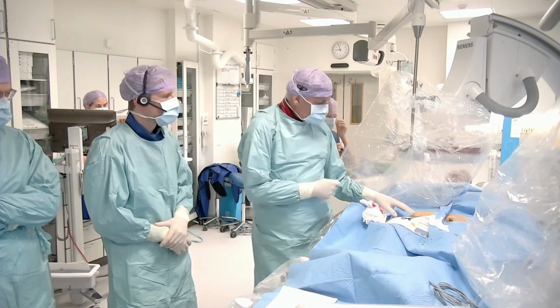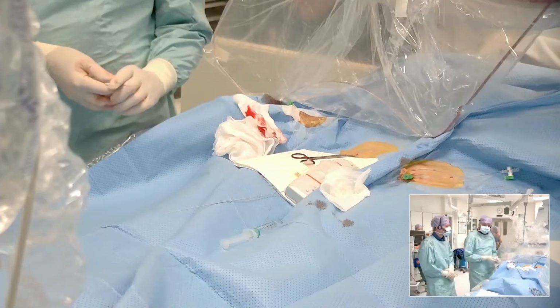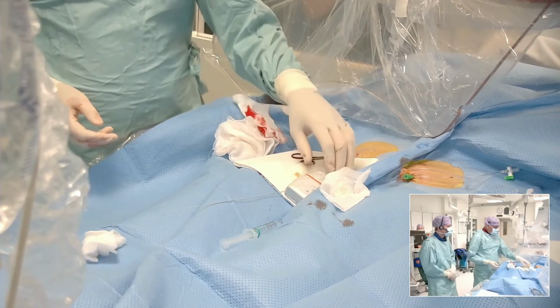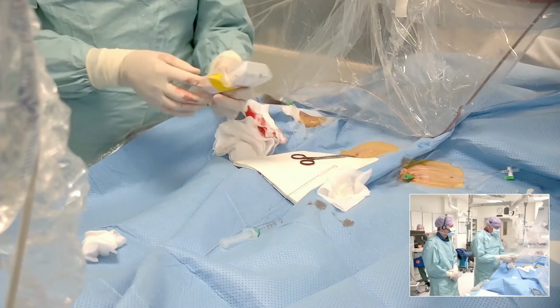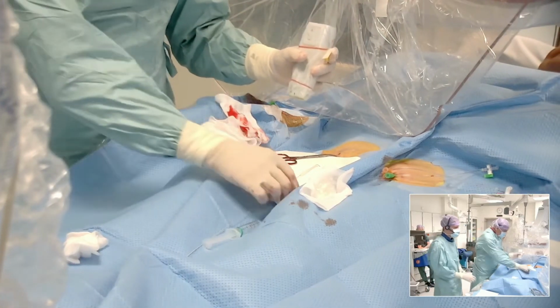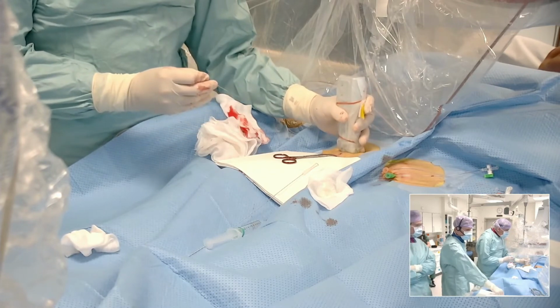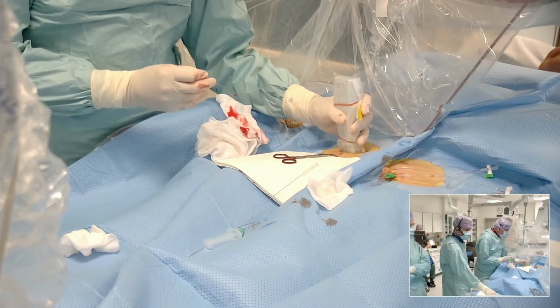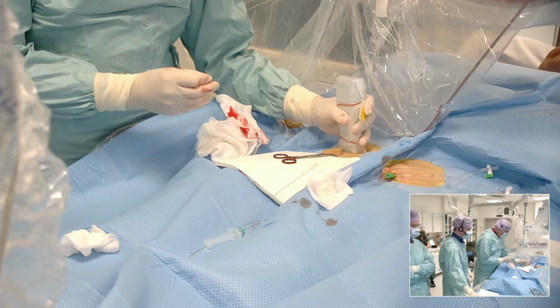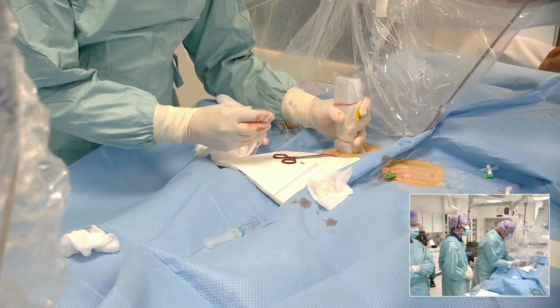So next thing is to puncture here in the right groin, the ipsilateral side, to introduce the delivery system a little bit later on. So I already put some local anesthesia here, and we can use ultrasound guidance to make sure that we're going to puncture in a calcium-free spot of the vessel.